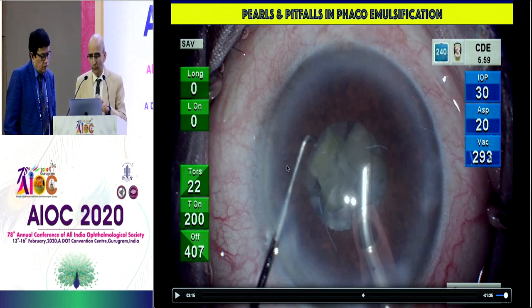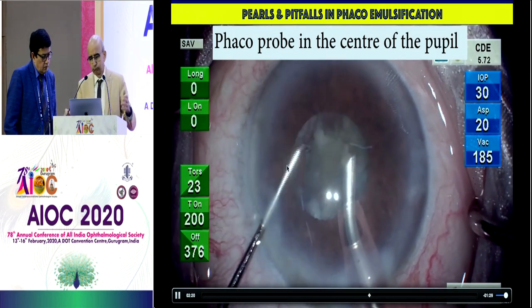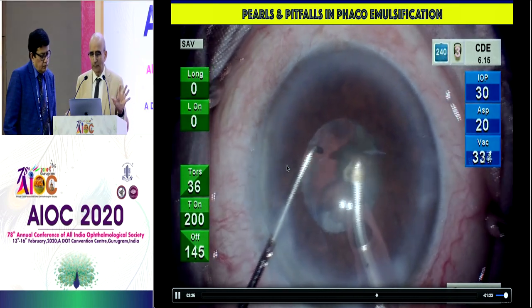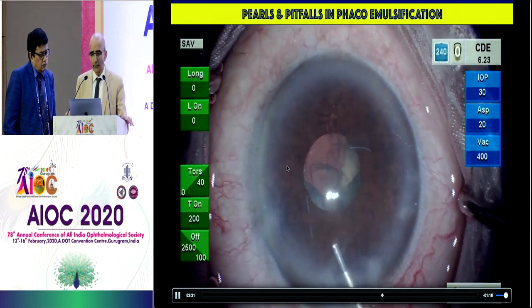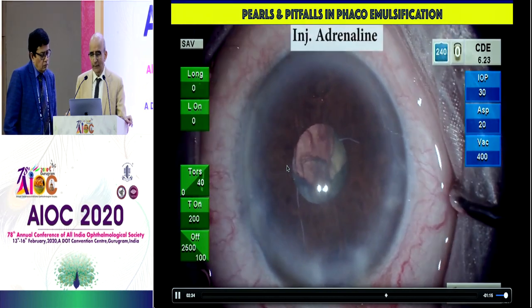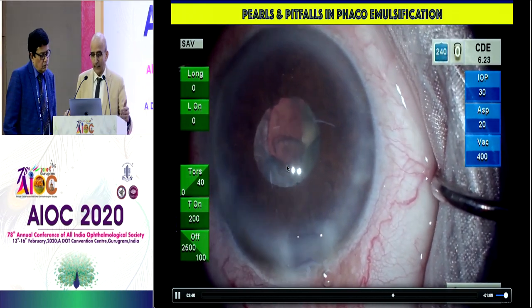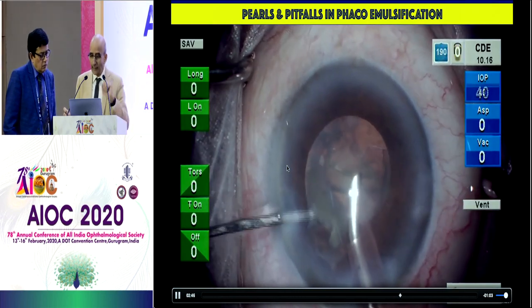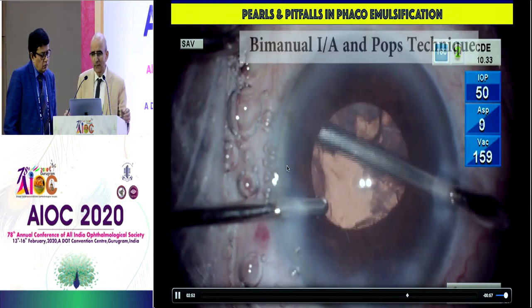The pupil constricted partly because of the fragments coming in vicinity, and already the trauma was sufficient that further turbulence constricted the pupil more. Keep the phaco probe in the very center of the eye and try to remove fragments with minimal movement. I'm injecting adrenaline here because I don't give up. I had the retractors ready and remembered Suven, but I'm resisting all that. Adrenaline did help — in spite of this trauma, keep in mind it may work. It's very simple.